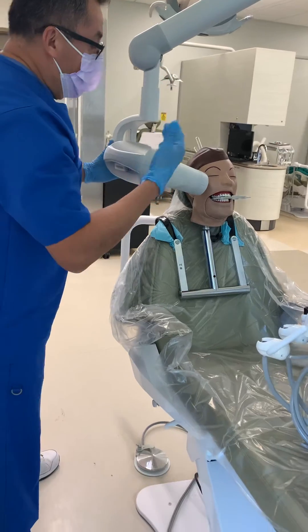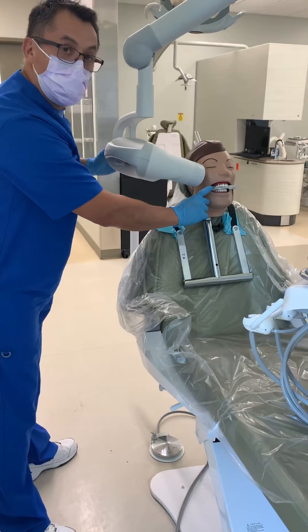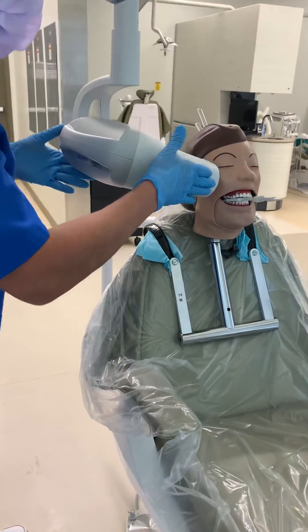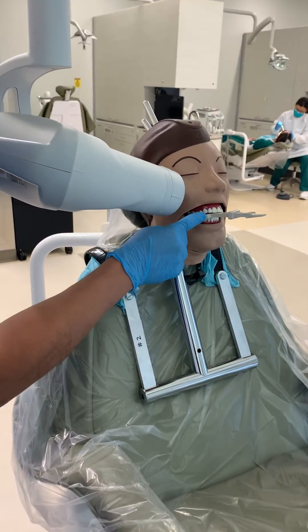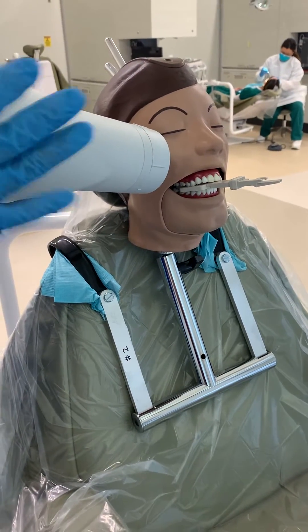Second, we already know that the edge of the film ends up at the mesial of the cuspid. So you're going to align this side of the PID with the mesial. If it's too hard to tell, you can always use this little corner as a reference. If you align it with that corner, you're pretty much there.